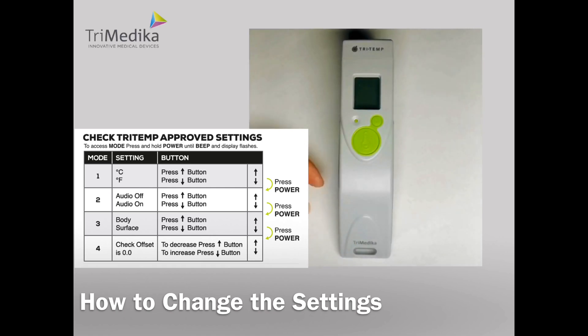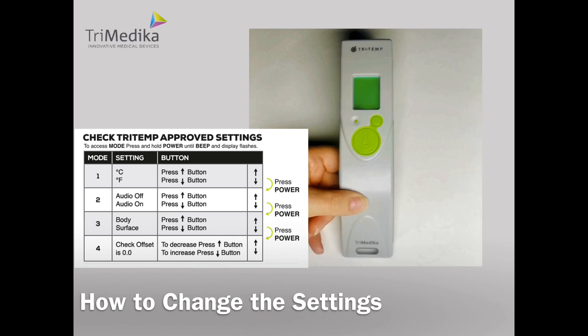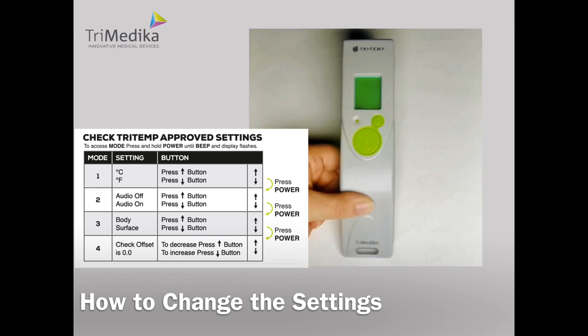Mode 2: audio on or off. We can see that audio on is flashing. If we want to change this, press up to turn audio off, and down to turn it on again. Use up or down to toggle. Press OK to select.